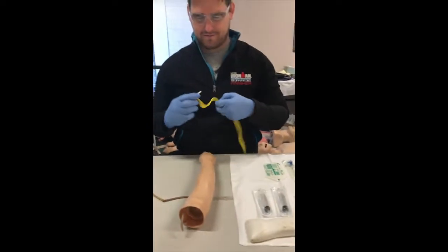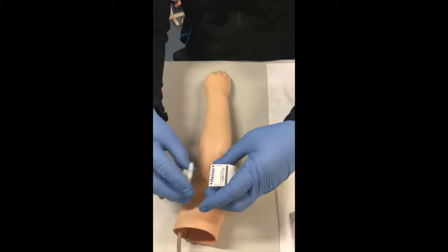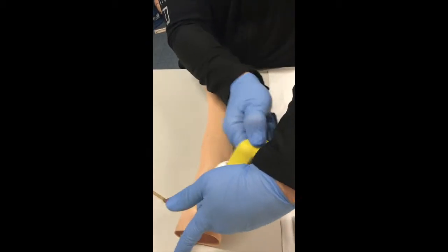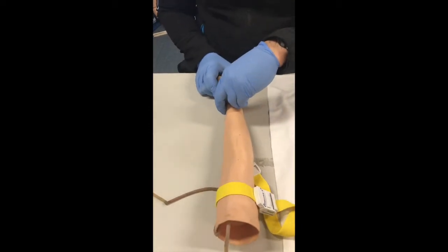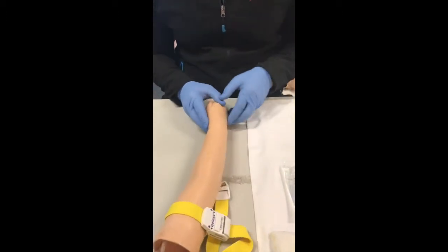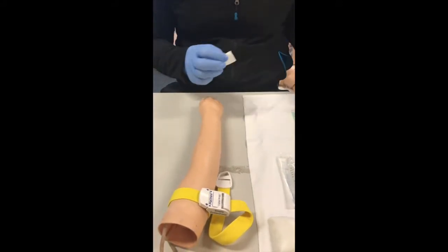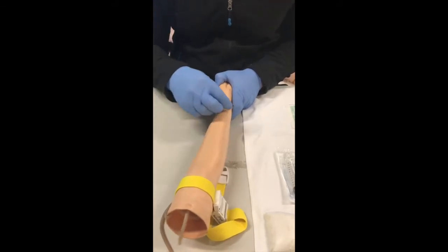Applying a tourniquet proximal to the arm, placing a finger underneath the tourniquet, ensuring that it's not too tight, and then checking to make sure you can still feel a distal pulse. Locating an appropriate vein, here the cephalic vein of the forearm of the child, and then grabbing an alcohol swab and cleansing the area and making sure that it is dry before proceeding.